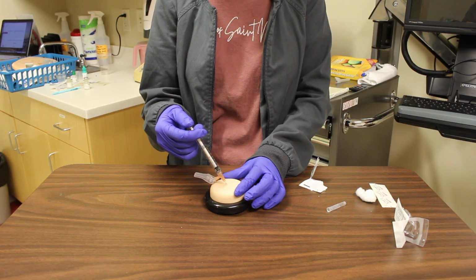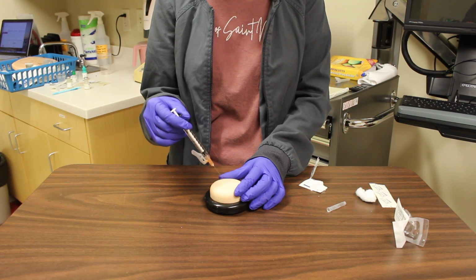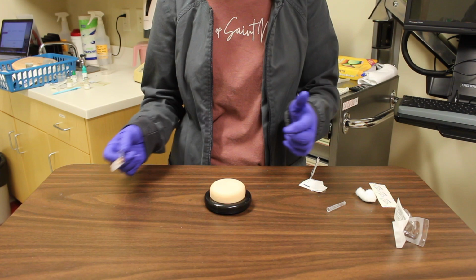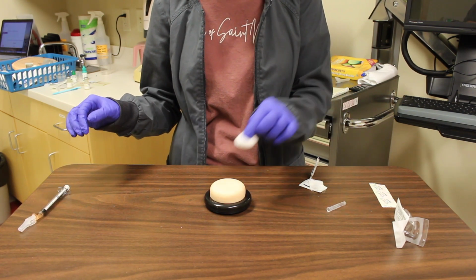Remove the safety needle smoothly along the line of insertion. Gently blot any blood with a gauze pad. Engage the safety needle device and place in the sharps container. Document administration of the medication and complete the ending 4 tasks.